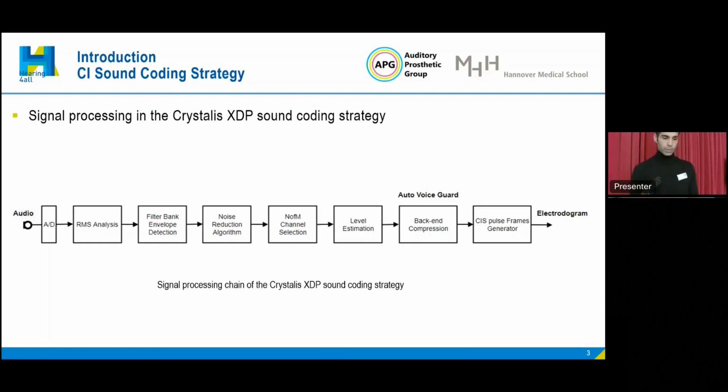One thing I would like to mention is that this backend compression system, called Auto Voice Guard, which I will refer to from now on, is optimized for speech in quiet, more precisely, speech when there is no background instrument present.